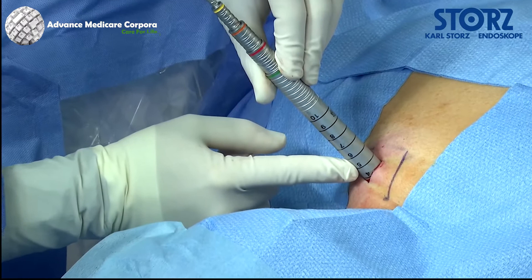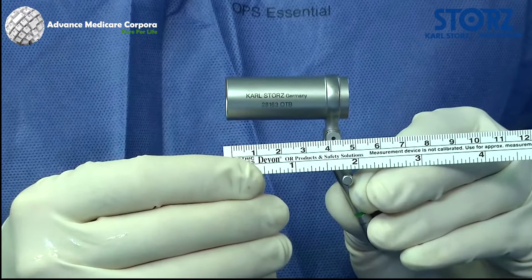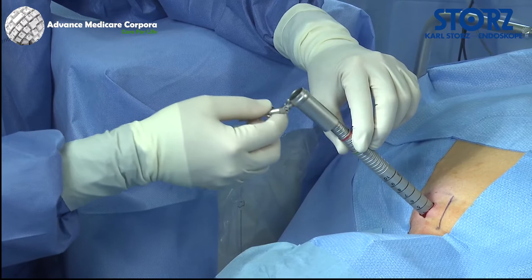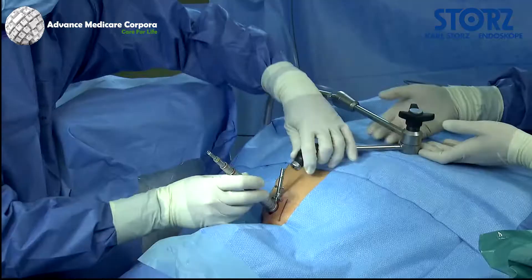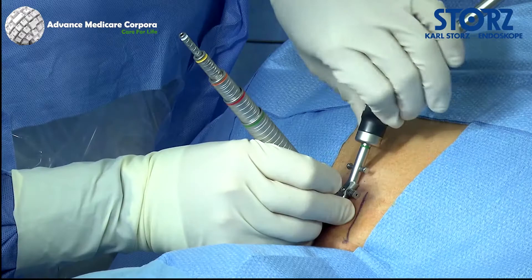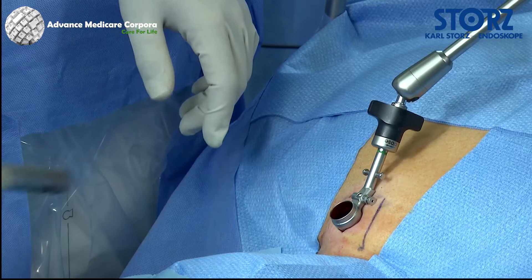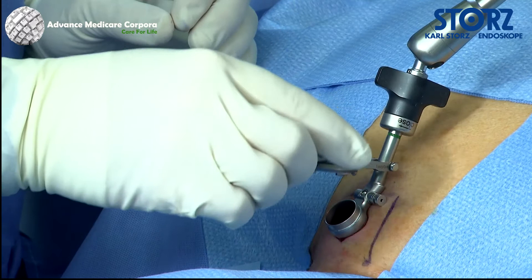After inserting the target sleeve, the length of the trocar to be used can be read on the centimeter scale. In this case, the green 19-millimeter trocar with a working length of 4 centimeters is used. Additional dilation or a changeover to another trocar is possible at any time. After the trocar is fixated to the holding arm, the dilation sleeves are removed. The entry site is controlled via lateral x-ray, and the selected telescope holder is placed on the trocar.